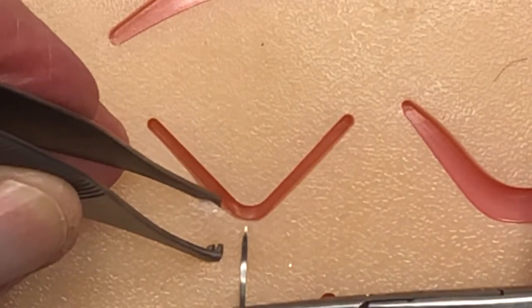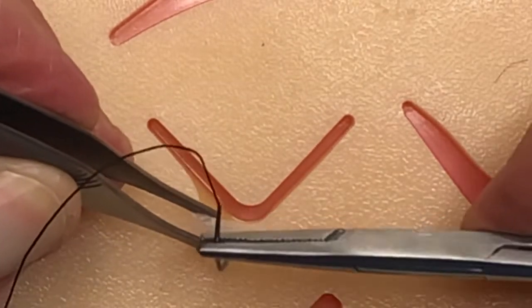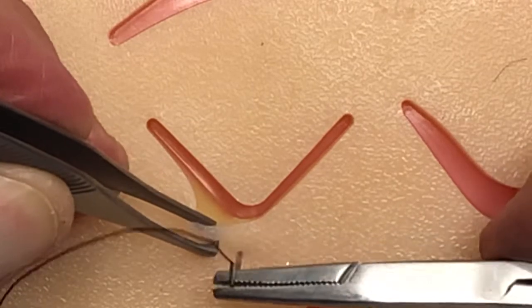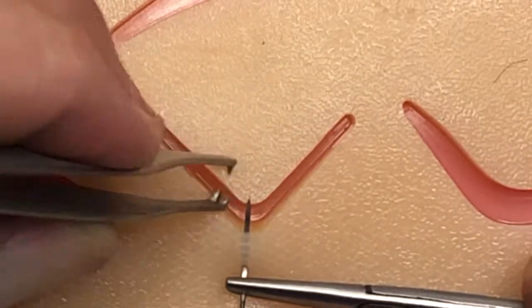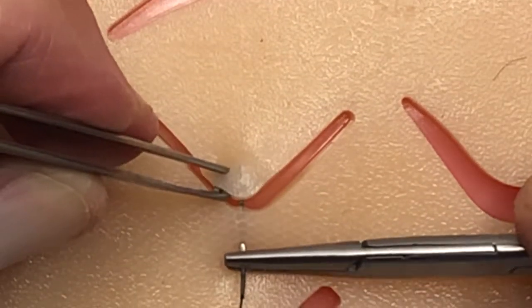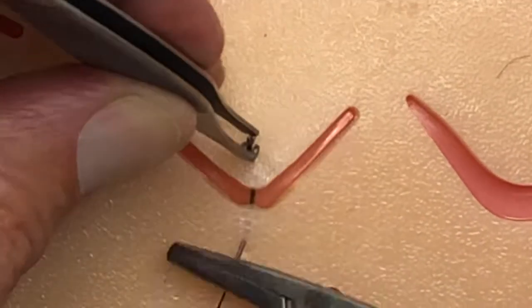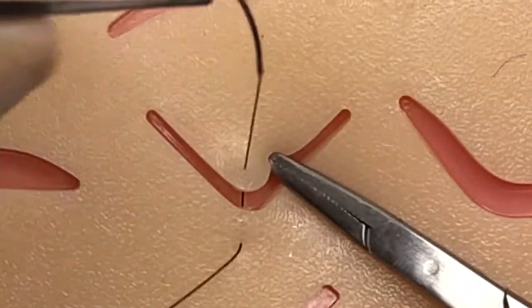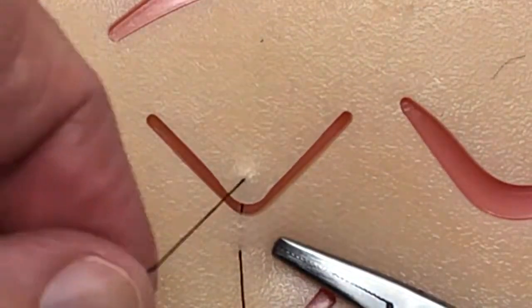So we're going to go in right here at the apex, coming in, trying to enter our tissue at 90 degrees, coming through, manipulate the tissue on the opposite side with your tissue forceps.